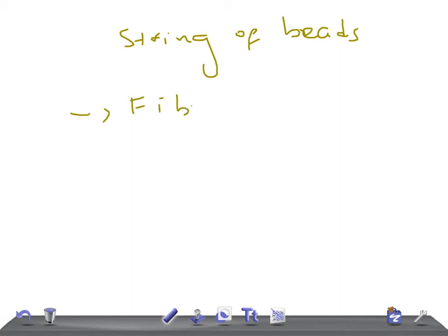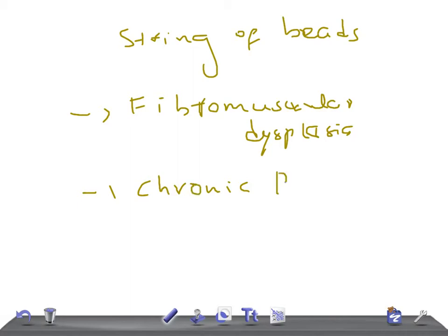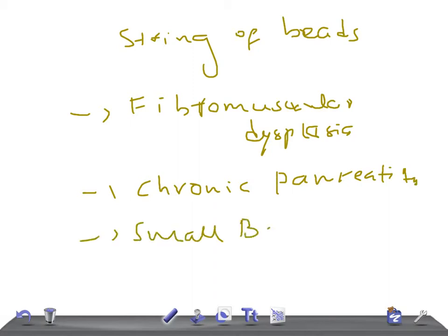Fibromuscular dysplasia — very important topic for your exam. Then we have chronic pancreatitis, and very important is small bowel obstruction.